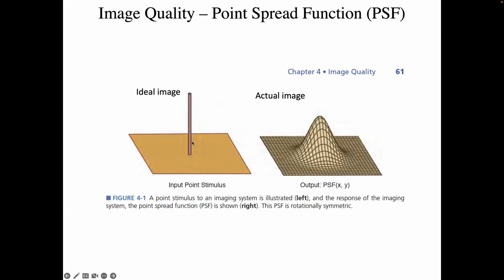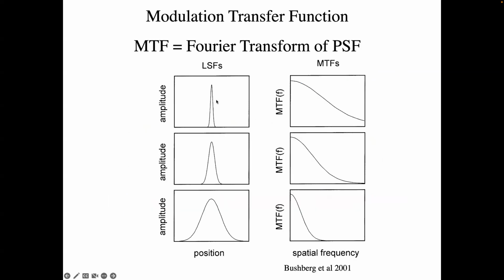And so when we do the experiment, this is going right back to the first lecture, we put in a very small metallic bead that's smaller than any voxel in our image and image it, and the image comes out, and this includes all of those factors, right? The point spread function that we create includes all of those factors. And you can quantify the resolution, as we said before, with this point spread function.